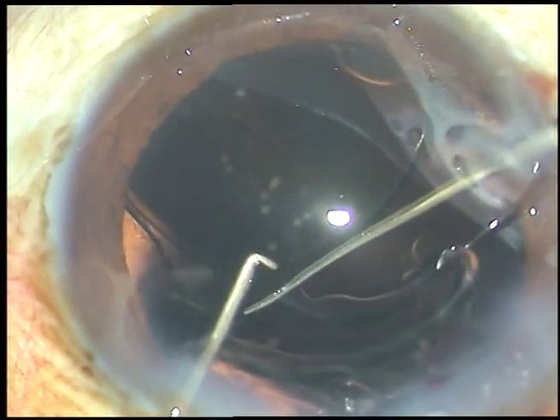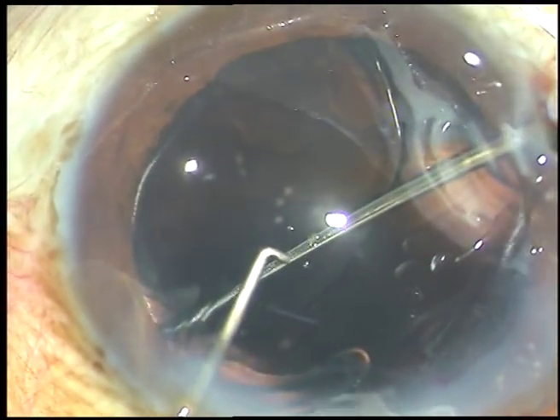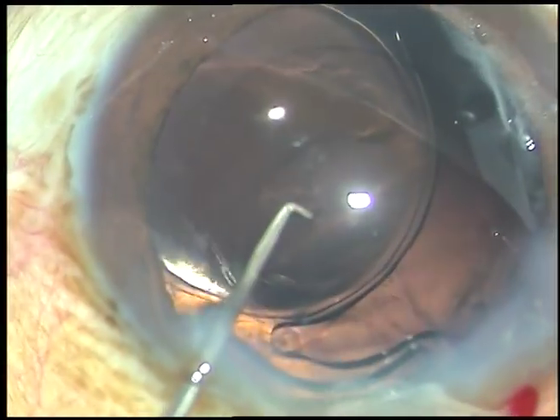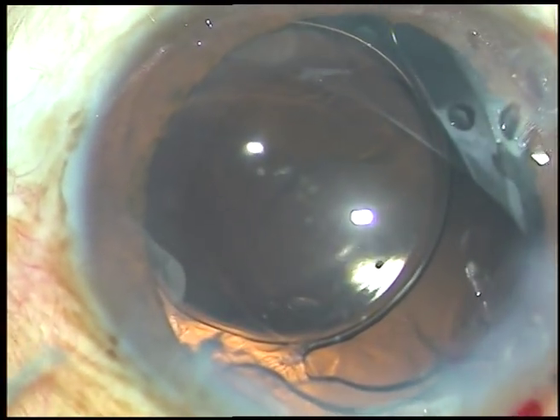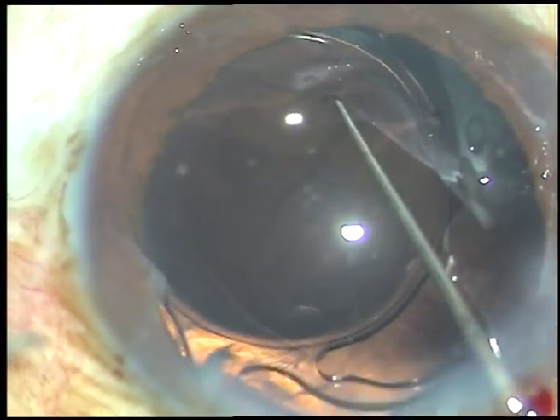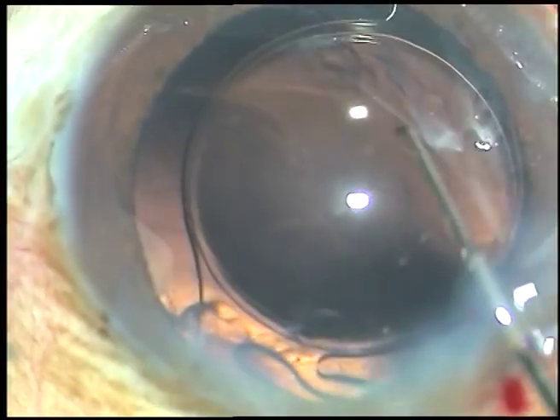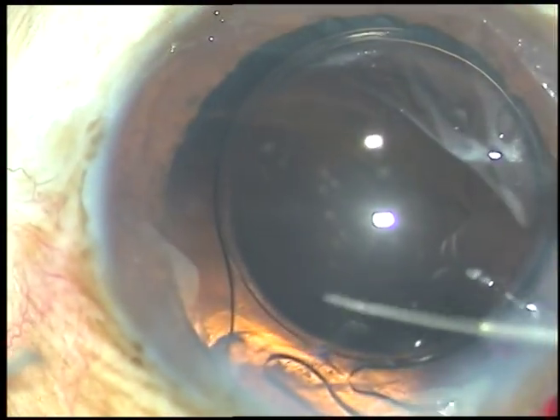The lens goes into the capsular bag. If I keep the lens at this position, the trailing haptic is nicely supporting the dehiscent portion of the zonule. But the mistake I did is I dialed the lens further.